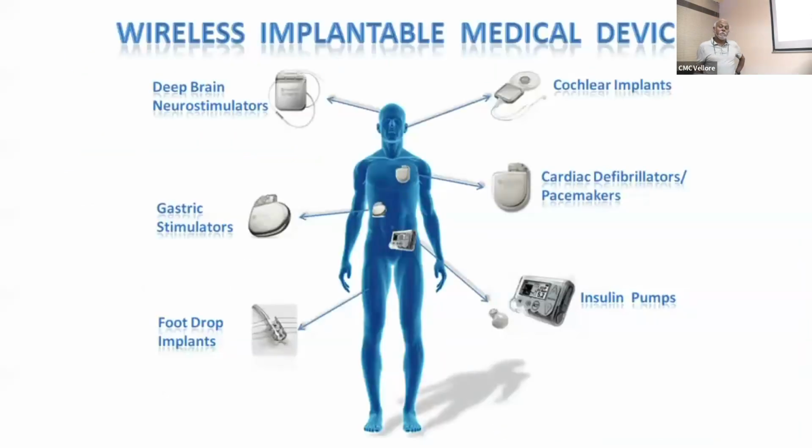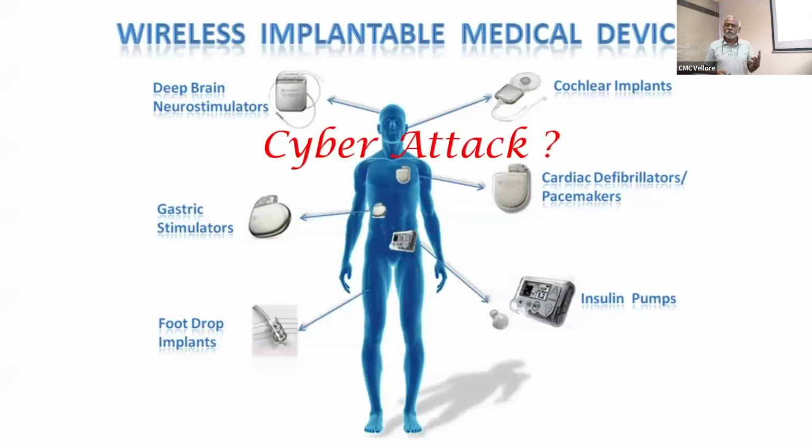So the thing is, now more and more the devices have become wireless and you can control them remotely. And I don't know whether you saw a movie recently where there was one actor who, they detect that he has an ICD and they remotely control it and actually shock the patient.